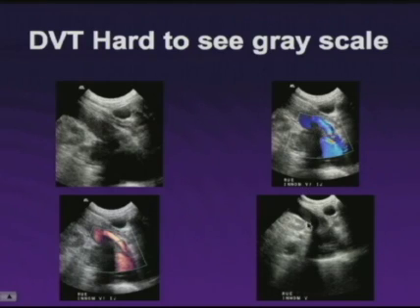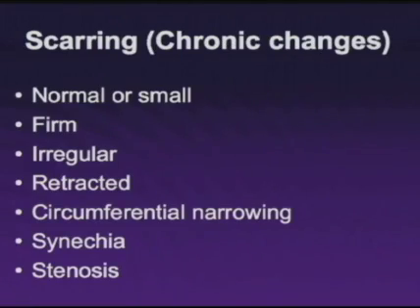And now, as we angle and rotate our transducer from a different orientation, we can see the echogenic thrombus projecting from a different wall in the innominate vein. So the color, again, can overwrite the clot, but also can point to clot in other cases.